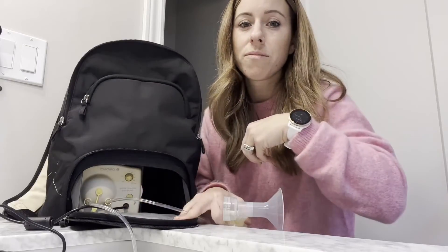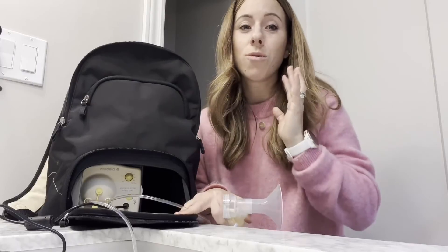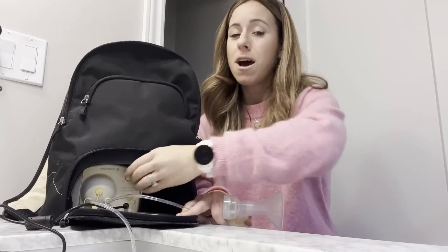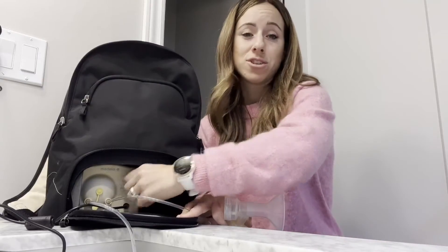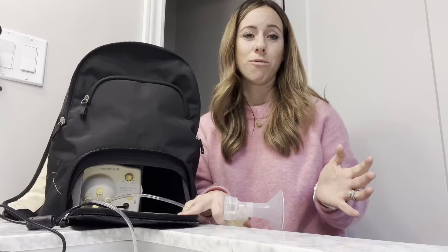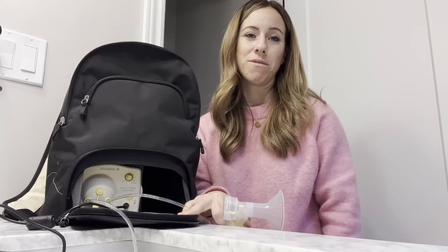I put this together in literally about 30 seconds, and turned it on in just a matter of one second. I definitely recommend this — it is incredible for all of you moms out there. But that's just my point of view.